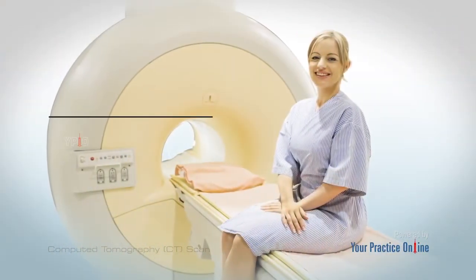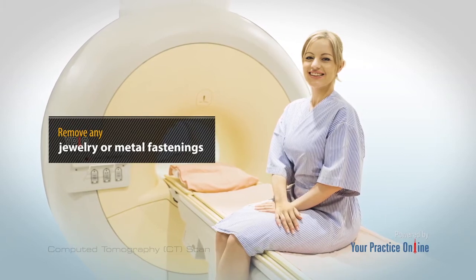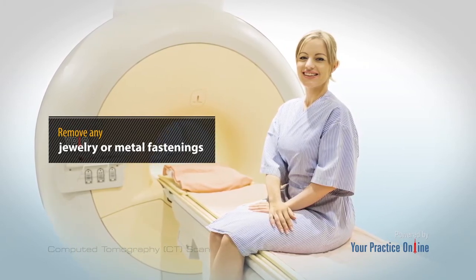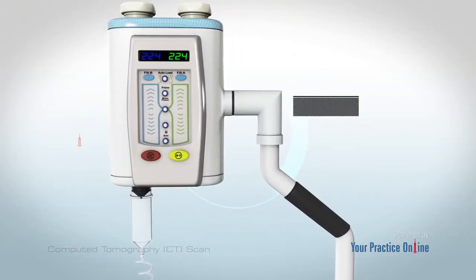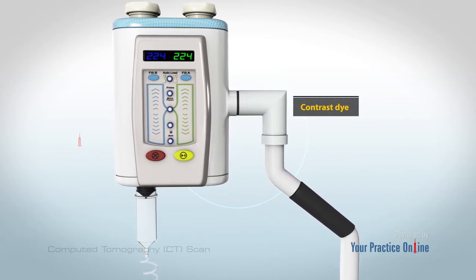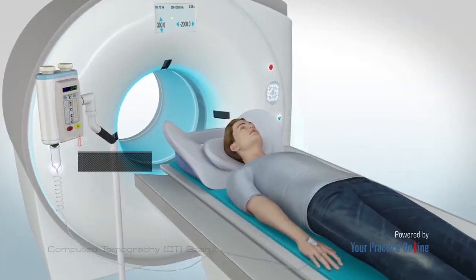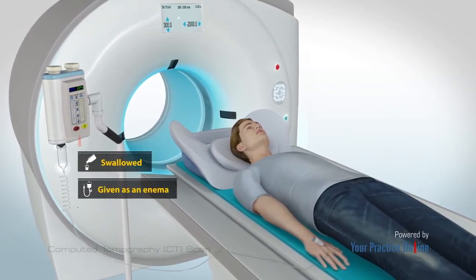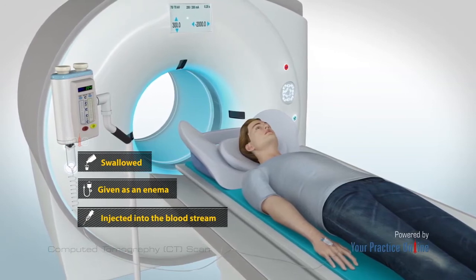Pre-procedural Preparation: You will be asked to remove any jewelry or metal fastenings in the area to be scanned. The scan may require a contrast dye or substance that improves the picture of certain tissues or blood vessels. This material may be swallowed, given as an enema, or injected into the bloodstream, depending on the part of your body that is to be scanned.